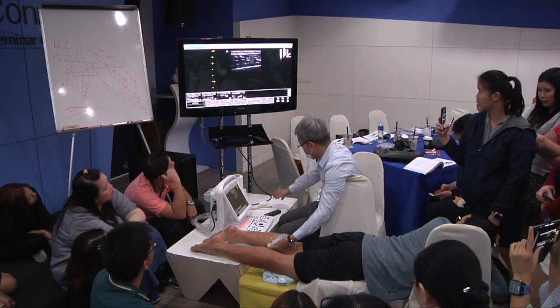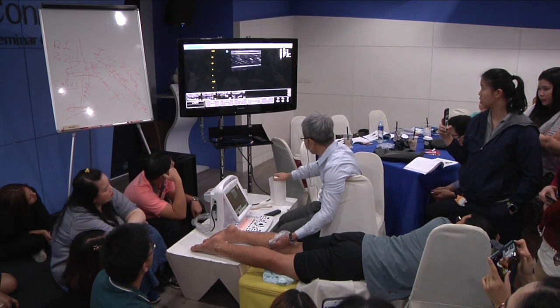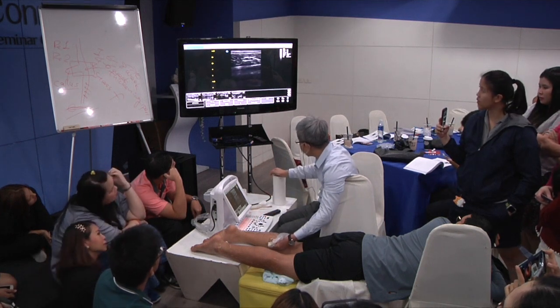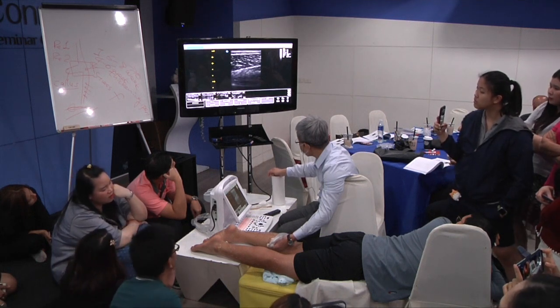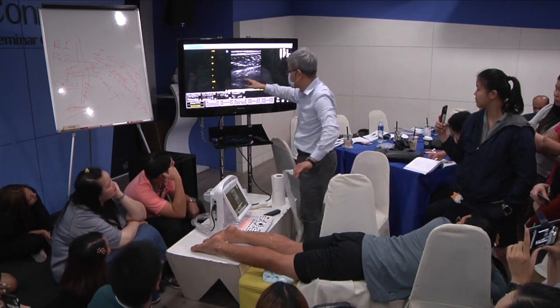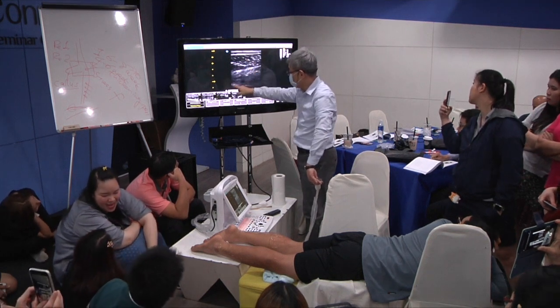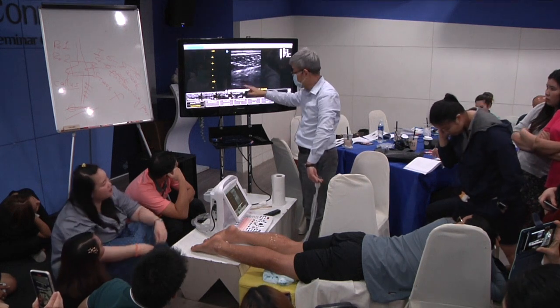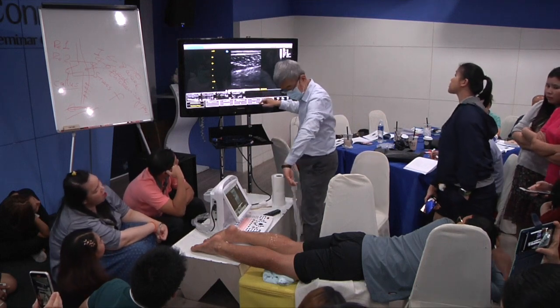For some papers and journals, they require you to see the tibia bone as well. Anyone want to do a study with the gastrocnemius? Skin, fat, and the tibia bone. And this is the fat. But sometimes, if you see muscle fiber here, it is flexor hallucis longus.